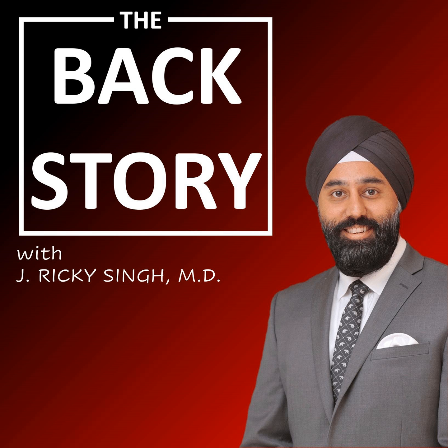So tell me a little bit about how do spinal cord stimulators even work, and how do you determine if a patient might be a good candidate for this therapy? Well, I think most importantly is that we have a clear understanding of what the condition is. For many patients, that can be challenging because they've had years of pain. They've had a number of interventions and workup done for them, lots of imaging and so forth, and they continue to suffer. So really this therapy is for people who have exhausted the more conservative things like you and I do every day, like epidural steroid injections or nerve blocks, use of various types of medication. So we're really looking for those that need something more than just the basic treatment.